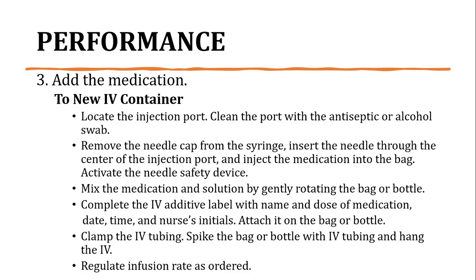First is to locate the injection port. Clean the port with the antiseptic or alcohol swab to prevent the introducing of microorganisms in the vascular system of the client and to ensure the sterility of the procedure.